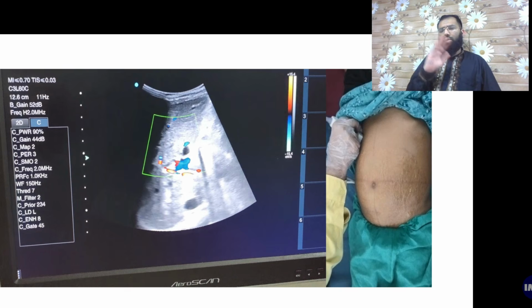Now, after you do all this, most importantly, sometimes you might also have other incidental findings, like we had in this case. There was a huge splenomegaly and portal cavernoma along with peri-GB collaterals. And interestingly, this patient turned out to be a case of sickle cell anemia. So a sonographer has to be very vigilant and needs to look for extra findings, and all those incidental findings or patient complaints of pain here and there should not be missed. Always we need to be curious and look into all these pathologies for a better diagnosis of the patient.